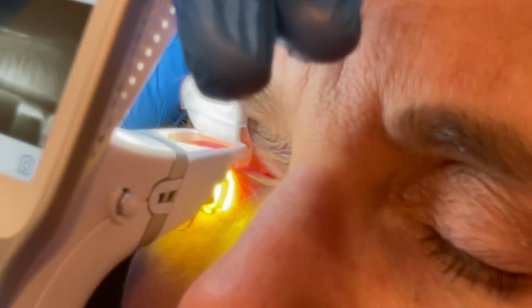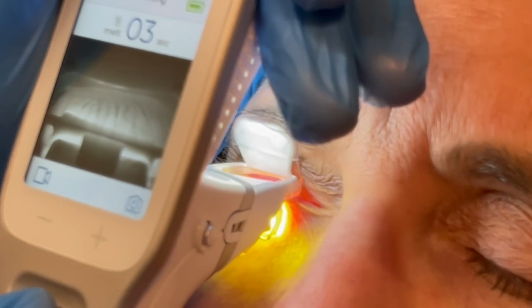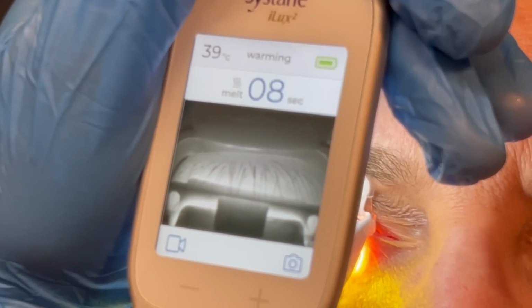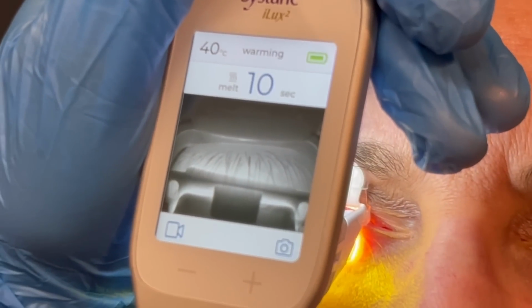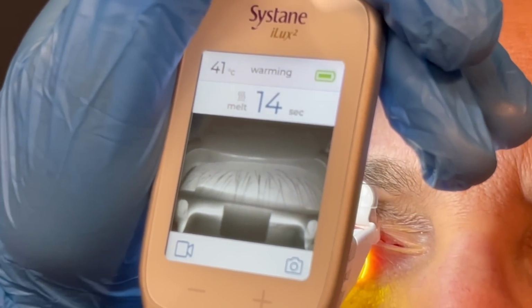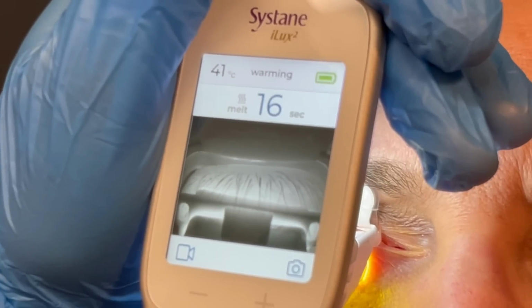And once it hits about 38 degrees Celsius or 100 degrees Fahrenheit, there's a little timer that starts. And we usually like to let this go for about 40 to 50 seconds to really melt all that juicy, hardened oil. It's like a candle wax consistency inside your eyelids.